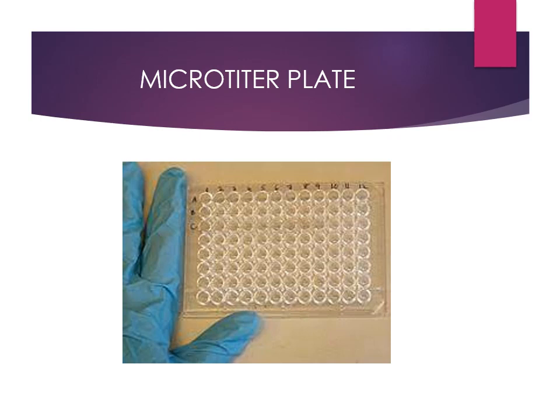In various tests, like the dengue test, chikungunya, hepatitis B, C, and HIV, everywhere we are using this ELISA. Usually the rapid tests which give a positive result are to be confirmed by the ELISA test. Now how can you sterilize this microtiter plate? It is sterilized by ethylene oxide. That is a favorite question: how to sterilize the microtiter plate.